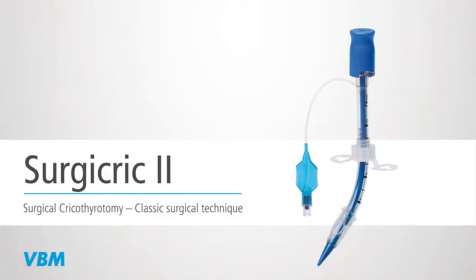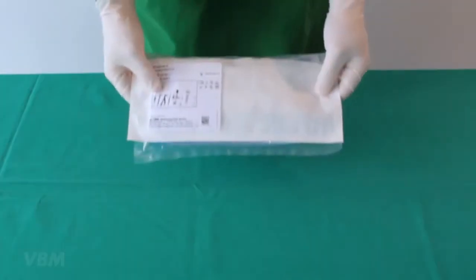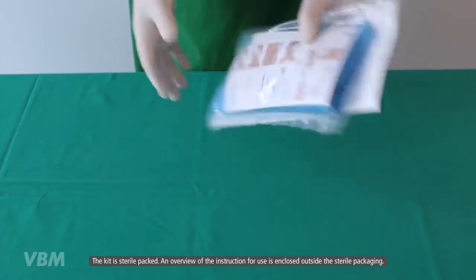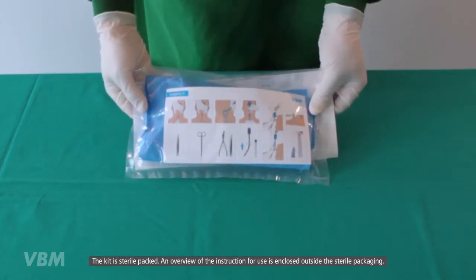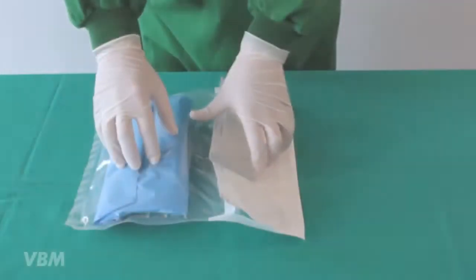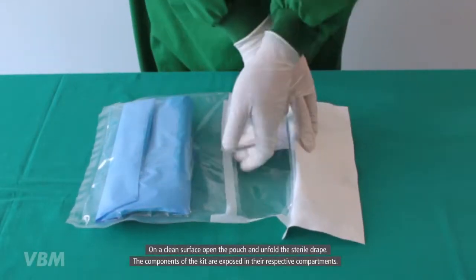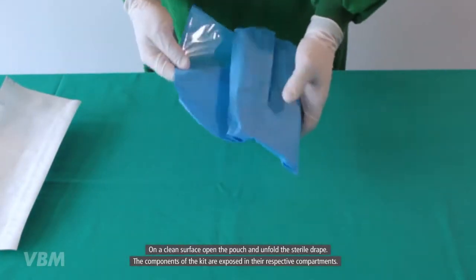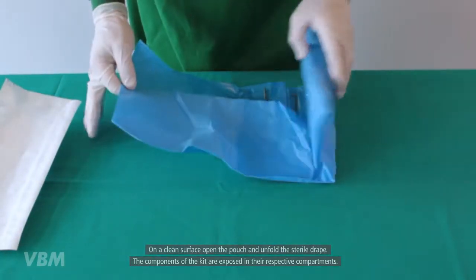The following video describes the insertion technique of the VBM cricothyrotomy kit called Surgicric number two, according to the surgical technique. The kit is sterile packed. An overview of the instruction for use is enclosed outside the sterile packaging. On a clean surface, open the pouch and unfold the sterile drape. The components of the kit are exposed in their respective compartments.